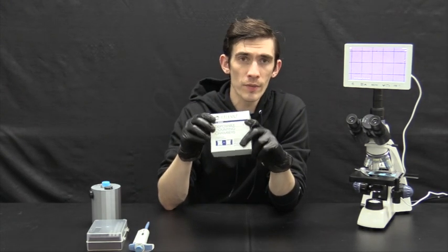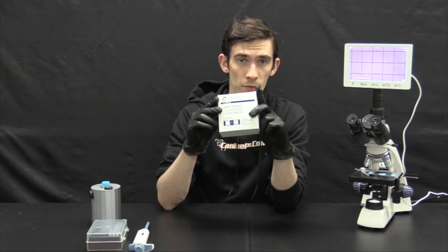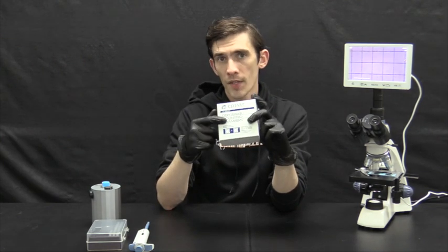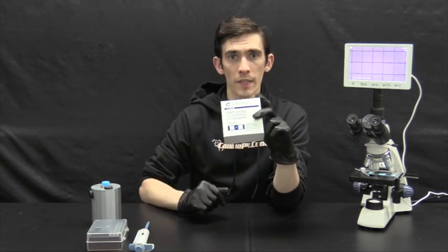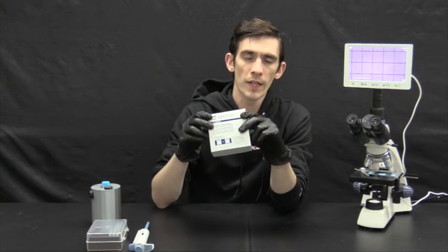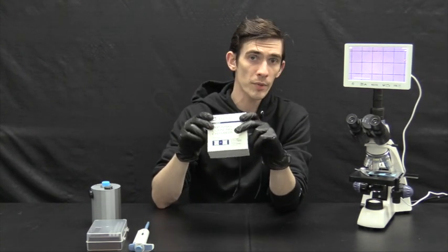So the math is actually so easy that all you do is count up the total sperms observed in 10 of the squares, which we'll show you later in the demo. Divide that number by two and you have your estimation in million per milliliter.